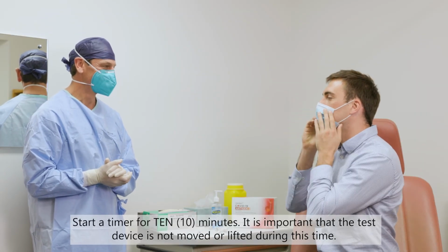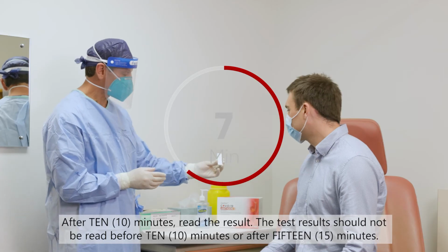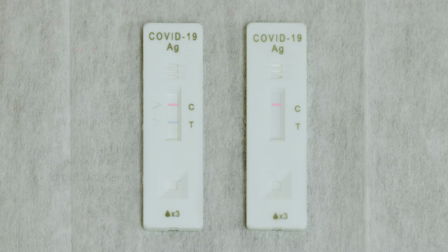Start a timer for 10 minutes. It is important that the test device is not moved or lifted during this time. After 10 minutes, read the result. The test results should not be read before 10 minutes or after 15 minutes.